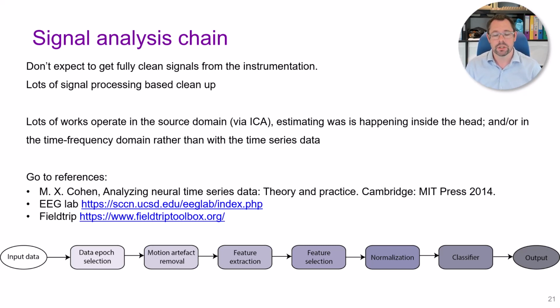It might be that a human sits down and interprets the data. It might be that it feeds into a machine learning algorithm and it triggers an alarm or whatever. It's going to be very application specific. I think the rule of thumb is that in terms of analysing an EEG signal, if you can think of a method, it's been applied to EEG. It's a very well studied area looking at different mechanisms.